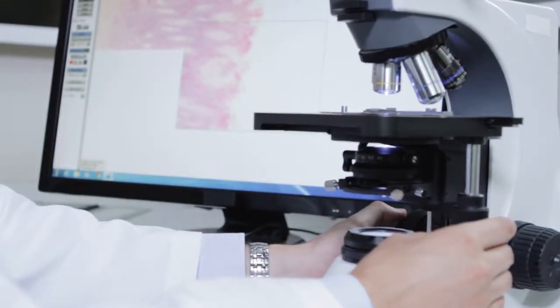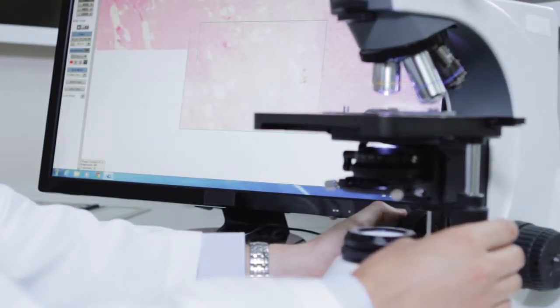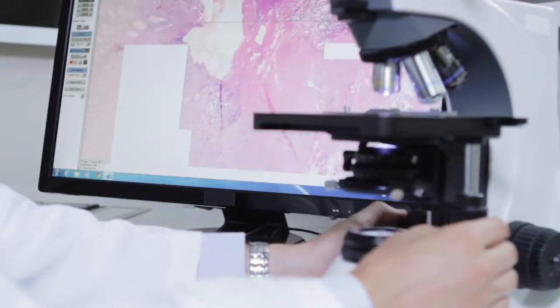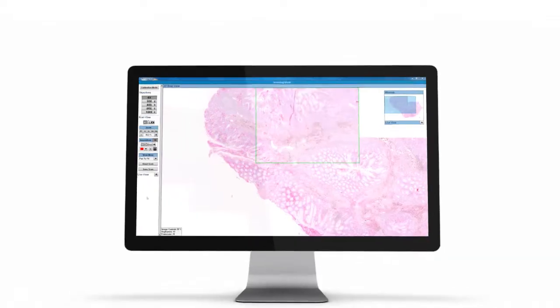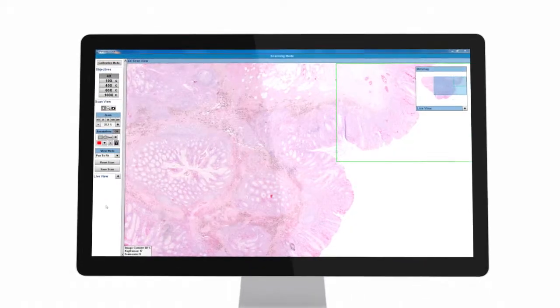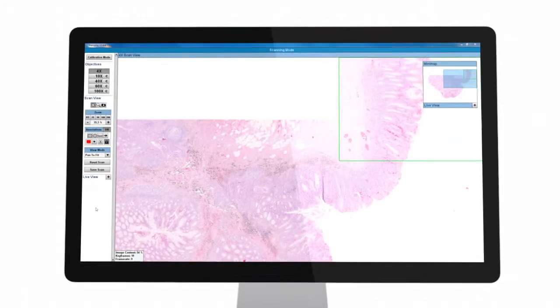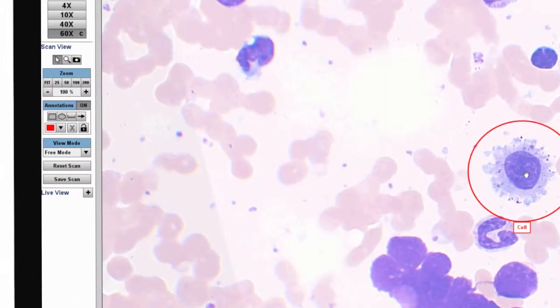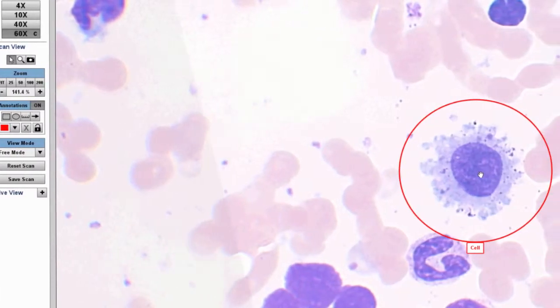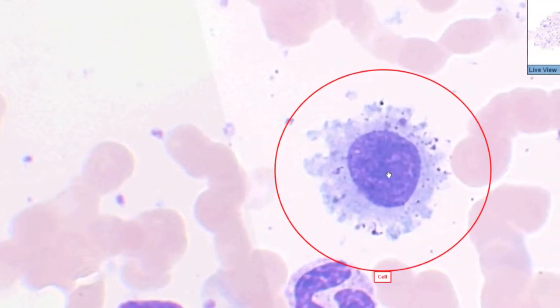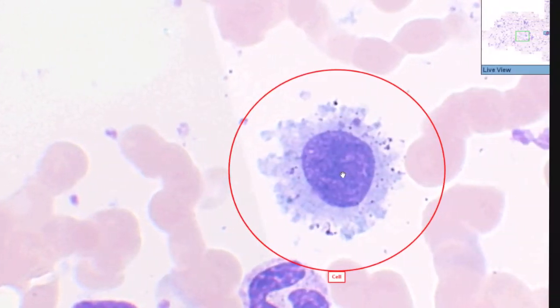Panoptic is able to stitch, in real time, what would normally be separate fields of view into one panoramic image. This allows users to dynamically zoom in to resolve detail to the level of the individual cell.